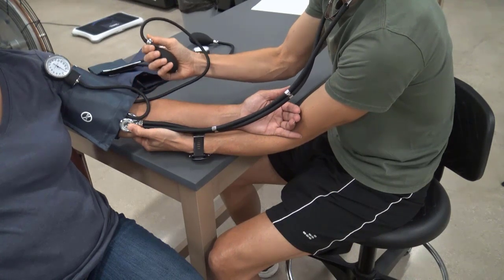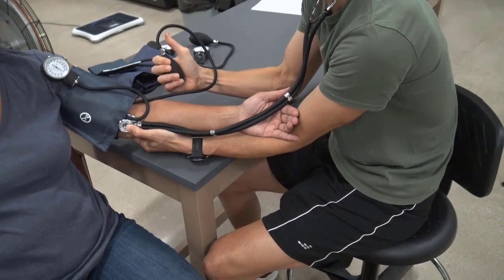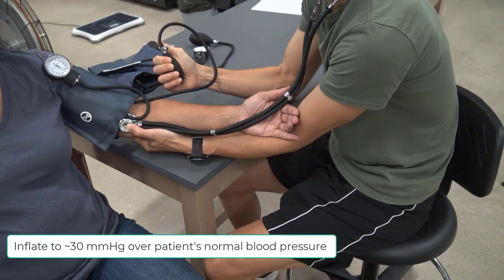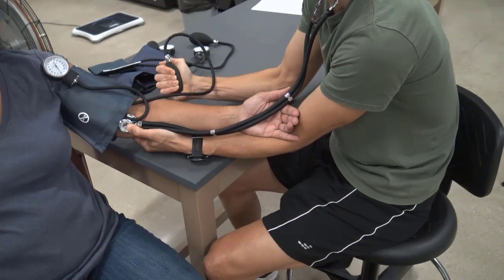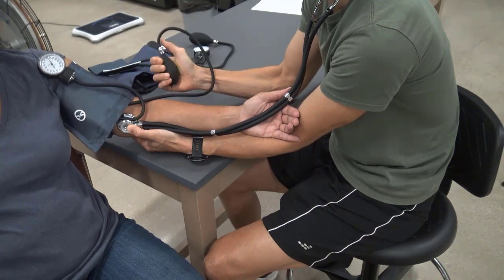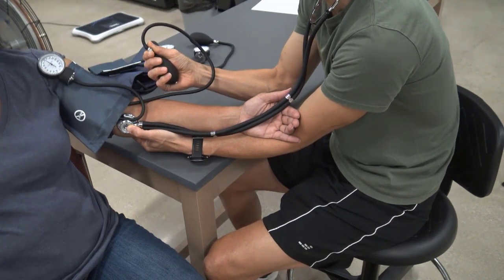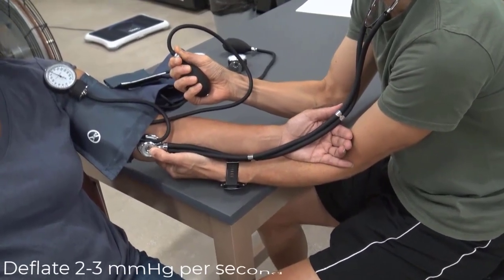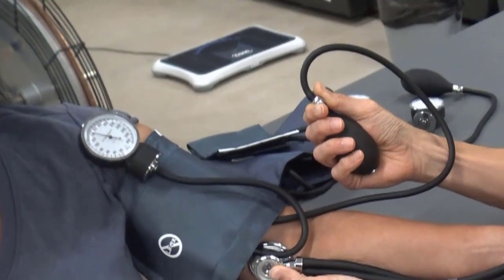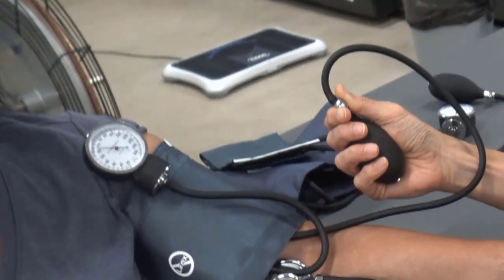Now comes the time to inflate the cuff. Quickly and forcefully squeeze the cuff to about 30 millimeters of mercury over the patient's normal blood pressure, or until there's a disappearance of the palpated systolic pressure. Immediately open the valve after inflating to control the release of air so that the needle is lowering about two to three millimeters of mercury per second. During this time, you are listening for sounds.